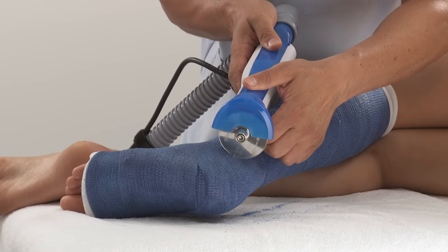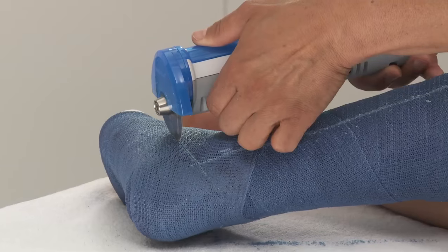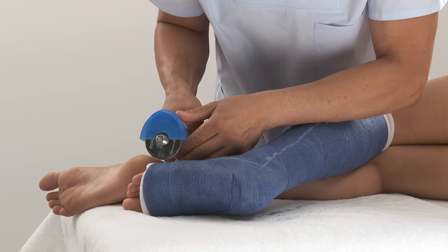At the ankle, saw a cut at a 90 degree angle. Saw until the middle of the foot, then start at the distal end, moving proximally.